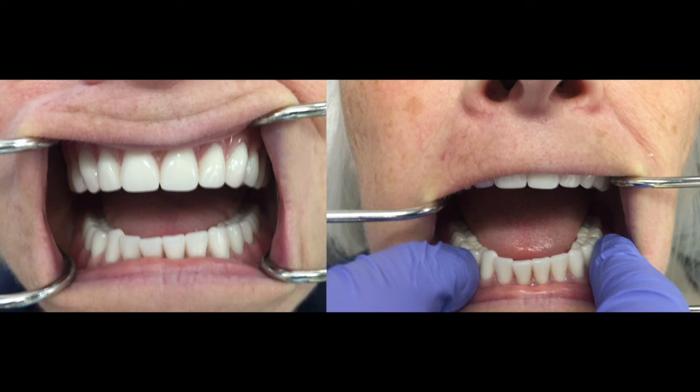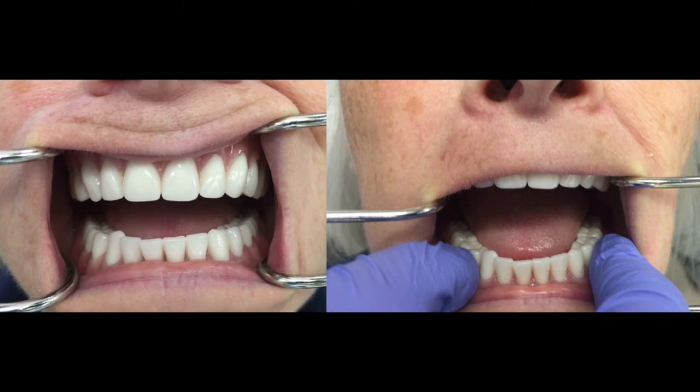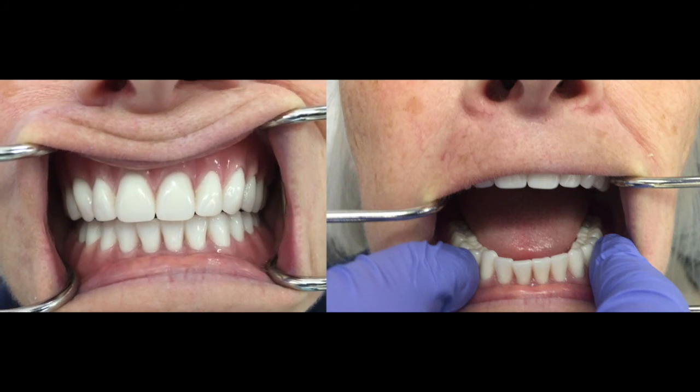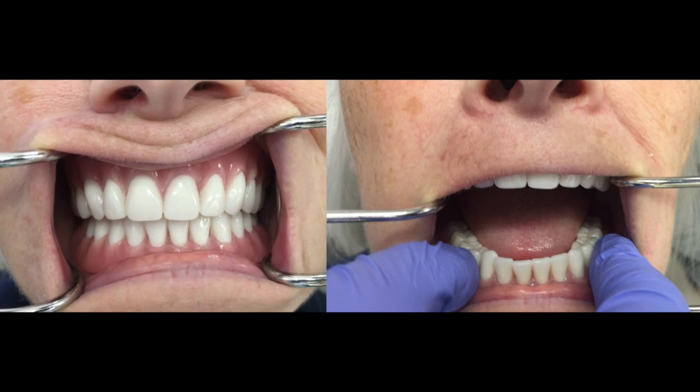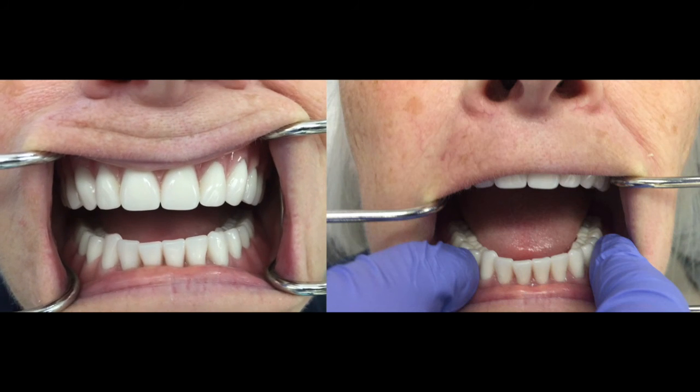When it comes to occlusion, it's extremely important to provide the CO contact first. Let's take a look at this video. Slowly close. One more time, open and close. Slowly, slowly.